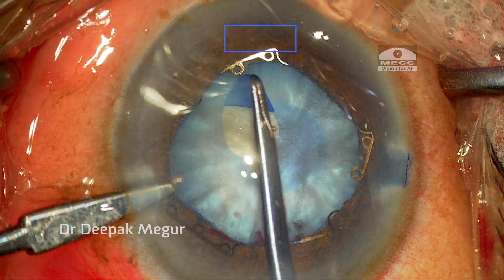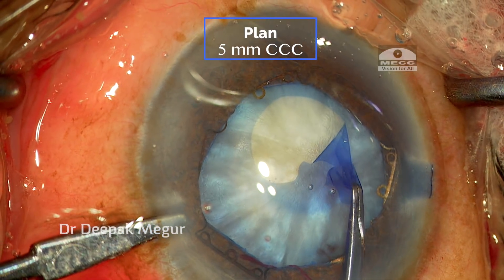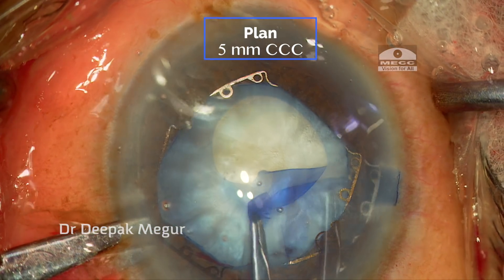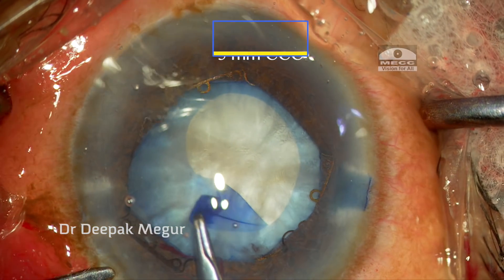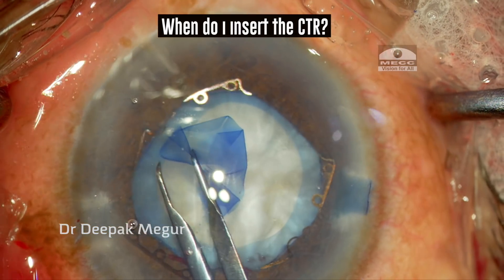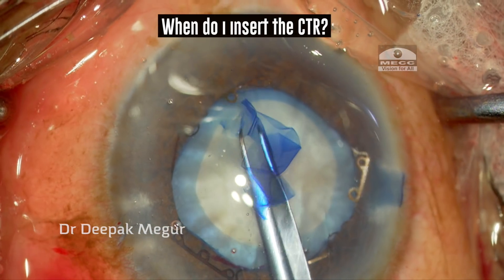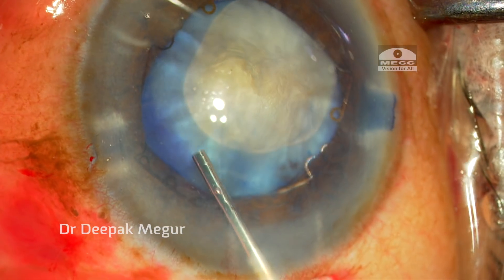The plan is to perform a five-millimeter capsulorhexis because my goal is to have an optic capture of the intraocular lens placed into the sulcus. The question I'm asking now is: when should I insert the CTR? Should I wait or should I introduce it now?